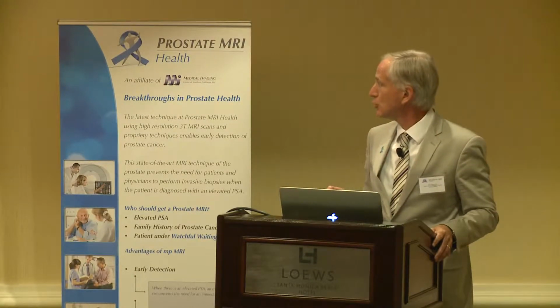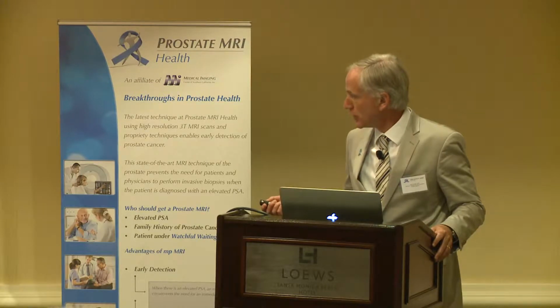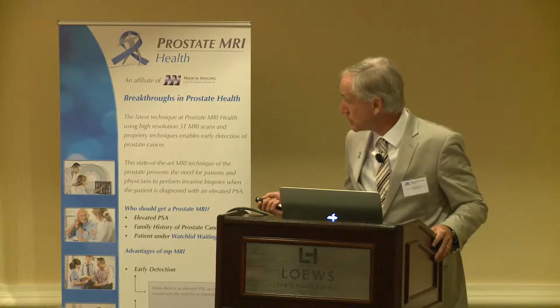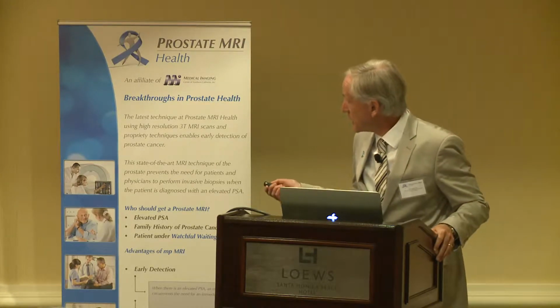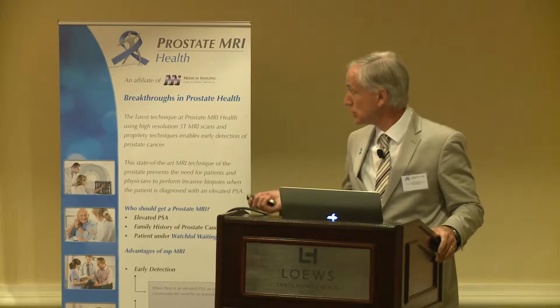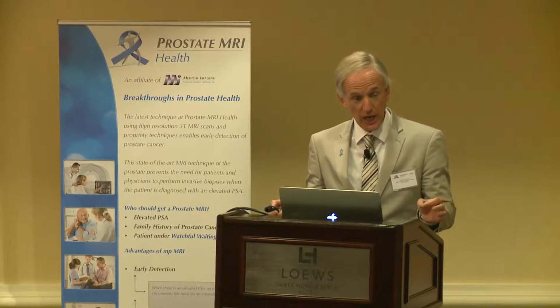Recently we got a technique called diffusion-weighted imaging. You're looking at the motion of water molecules in between the cells and in the cells. And if they move freely, the speed is high, it's white on the image. However, if you have dense, tightly packed cells, the motion of water molecules is reduced and you will see a black hole. This is quantitative information which you can acquire. So this is a tumor. This technique provides specificity and gives information about tumor aggression.